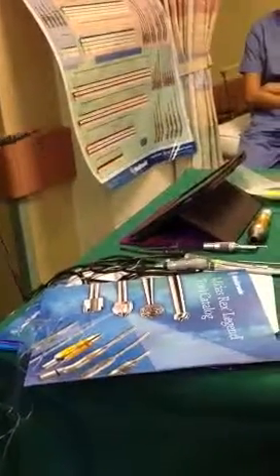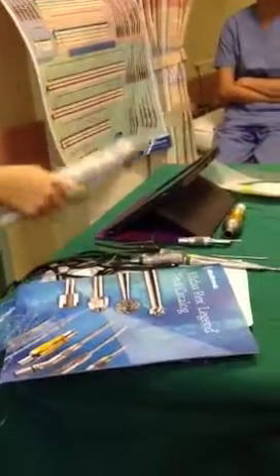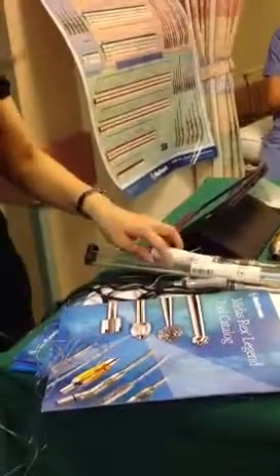Okay. Now we are going to have a practice. We recently had this, and this is more for the cleaning. For these hand pieces, you know this connection, right?